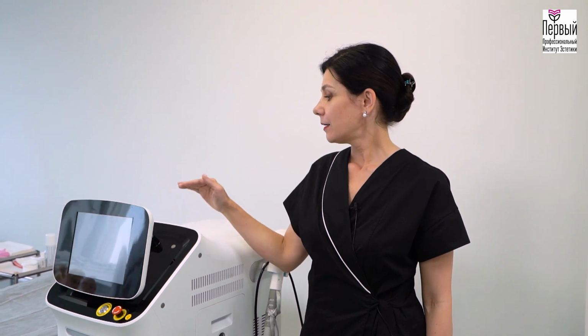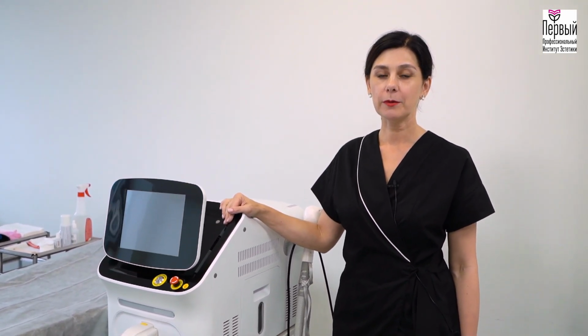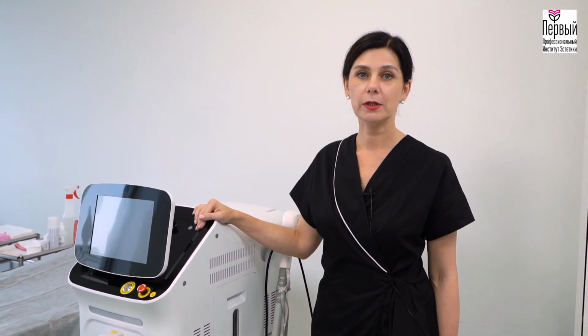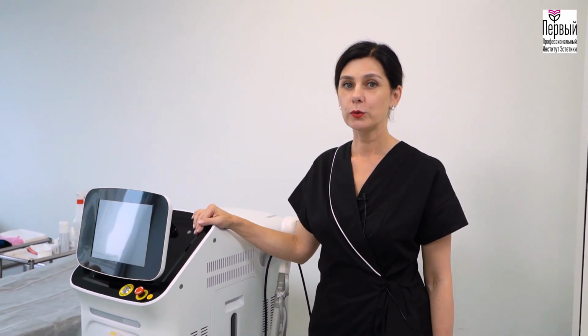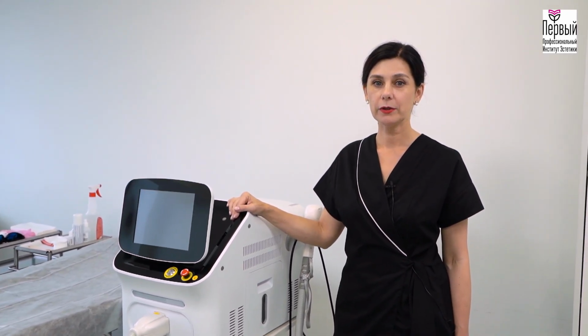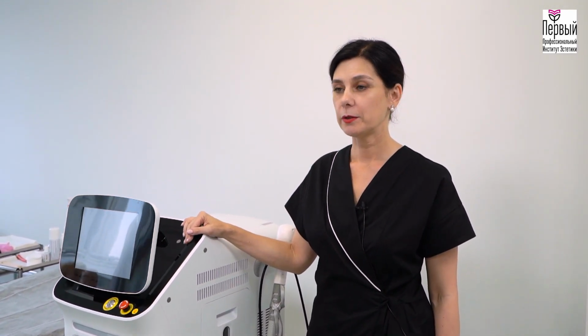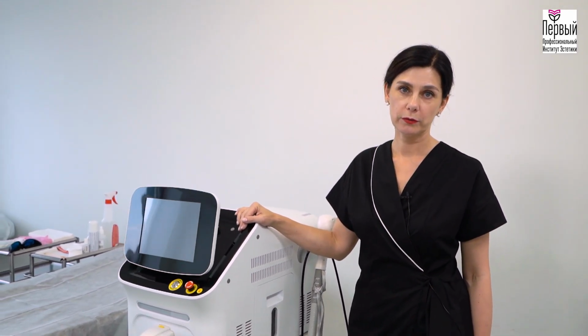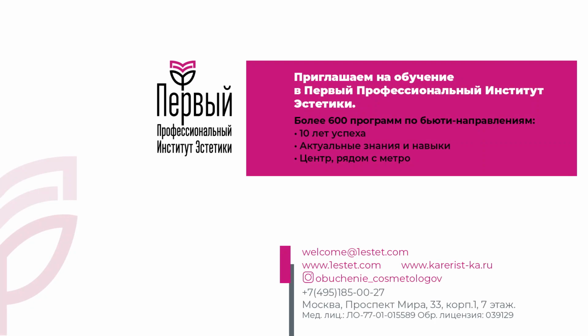Supply and exhaust ventilation is necessary due to the large amount of nitrogen oxide produced during the operation of the laser device. This is a toxic volatile substance, but what makes it really dangerous is the time of exposure rather than the amount. Therefore, the room must be ventilated to make sure that this volatile substance is evaporated. First Professional Institute of Aesthetics.